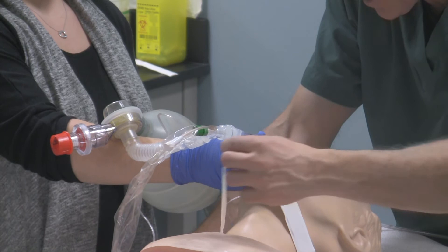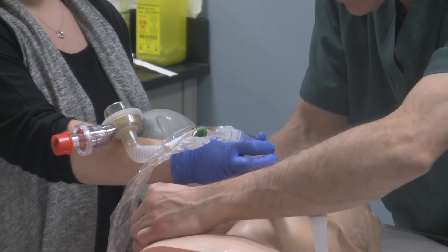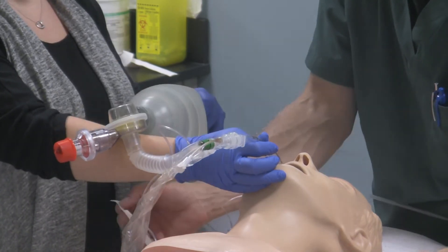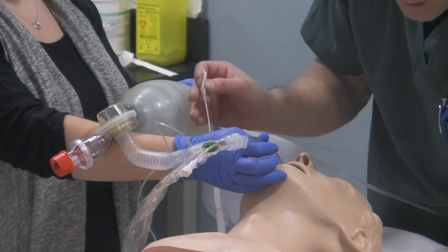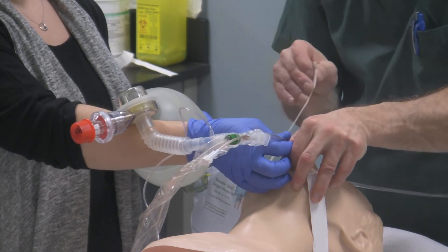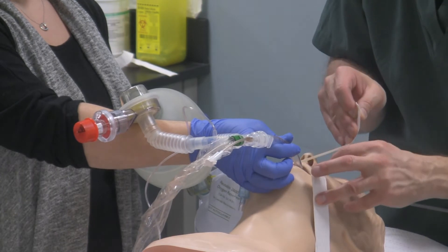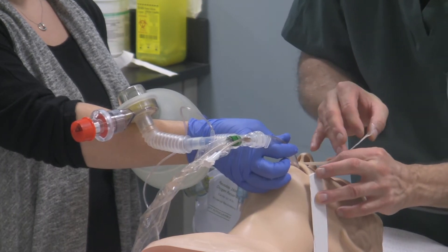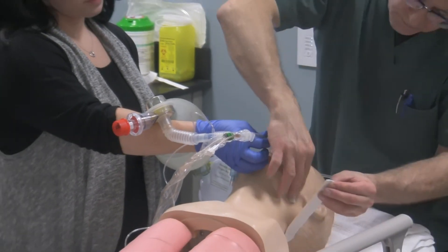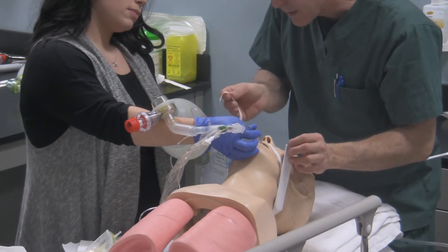Donald, this ripping is not your skin — it's the tape I'm using. I've got the tape now. The bottom tape is going to come under the patient's earlobe, go between the nose and the upper lip, go right across his face and down the other side. That's the first tape. The second tape — the top tape — is going to come up.